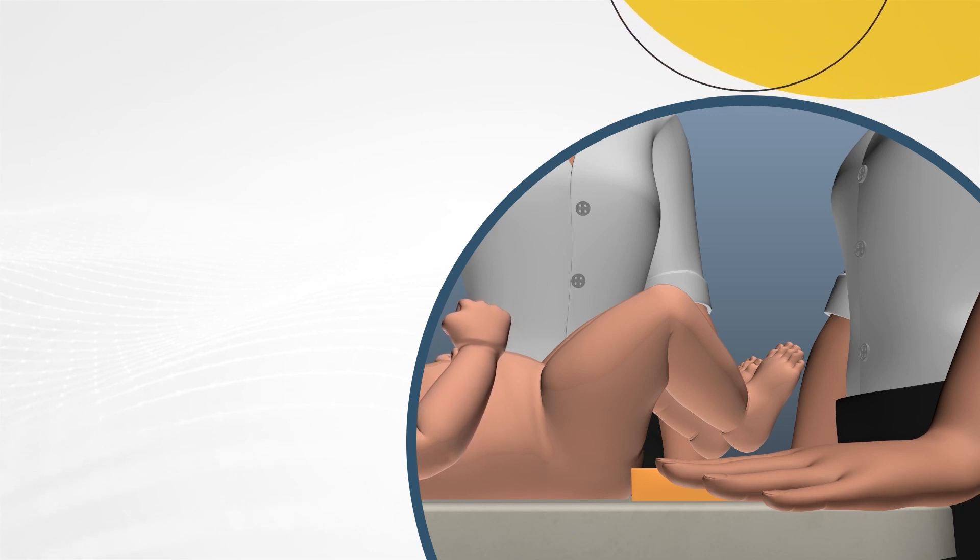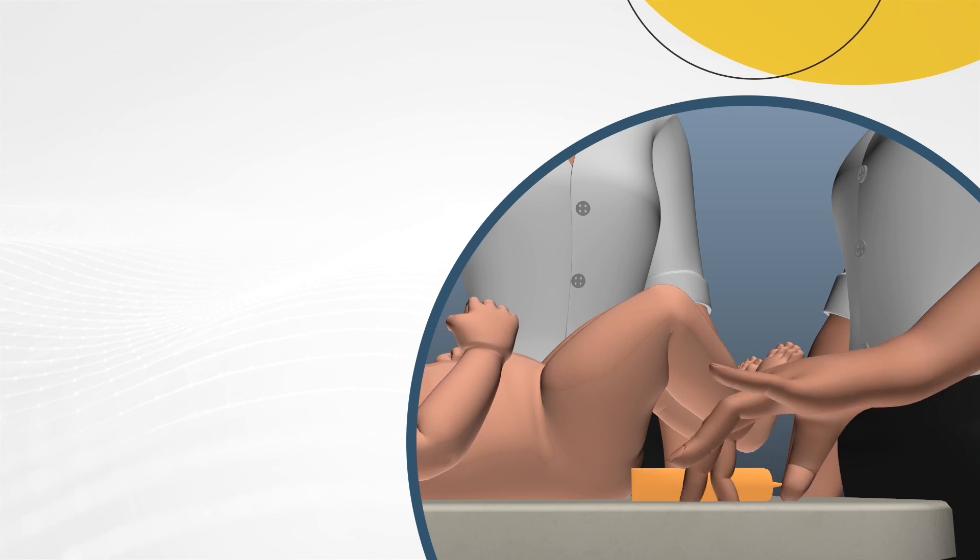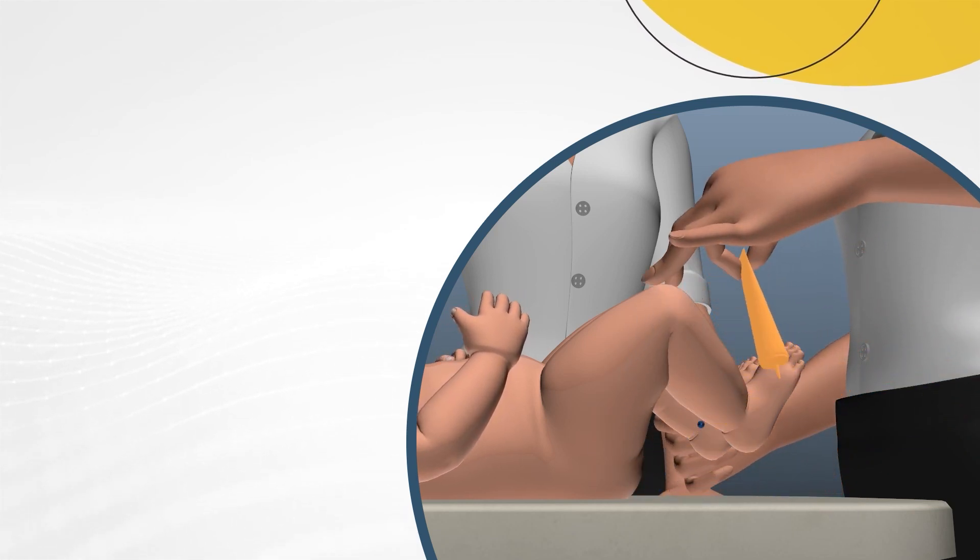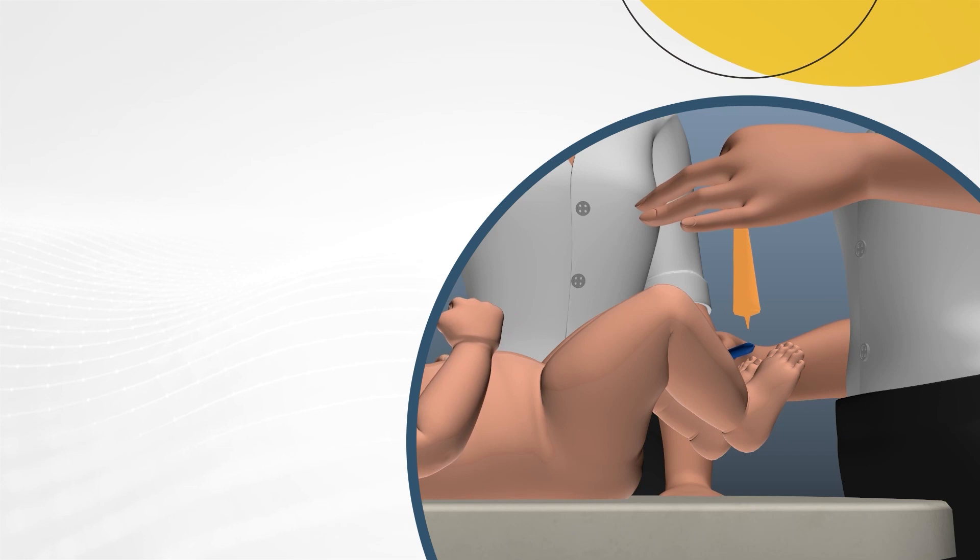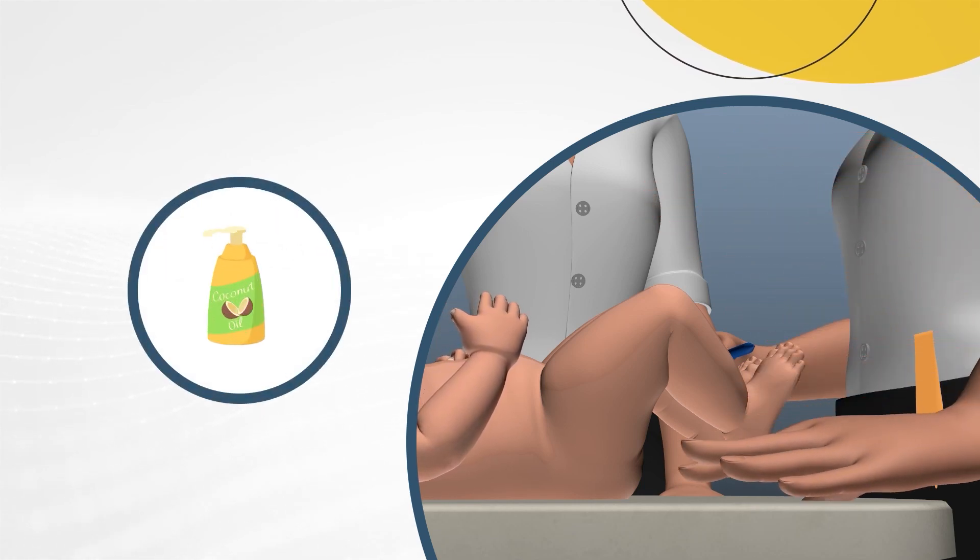The procedure can be done alone or you may take the help of another person. Ensure your child is lying in a comfortable position without napping. Apply the lubricating jelly provided by your doctor, or you can also use other home-based lubricants such as coconut oil, paraffin oil, or olive oil on the dilator.